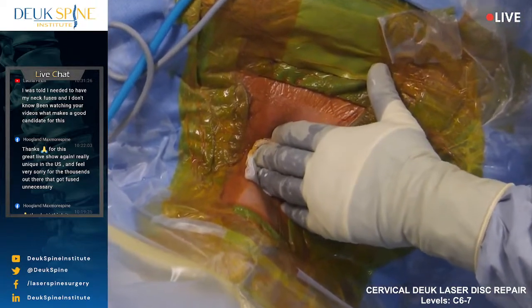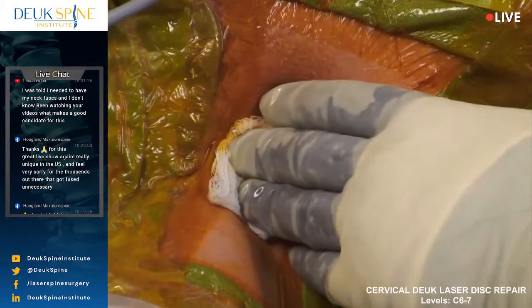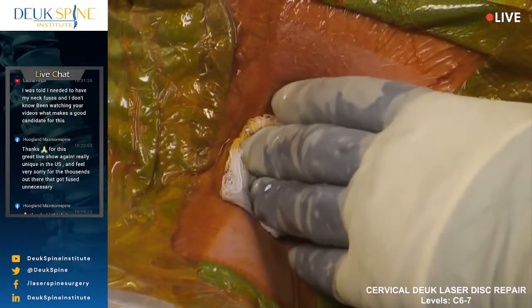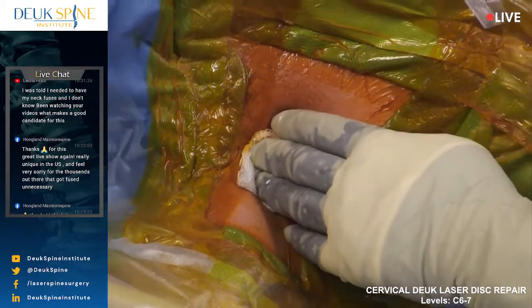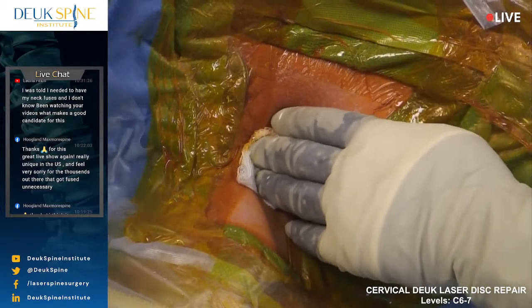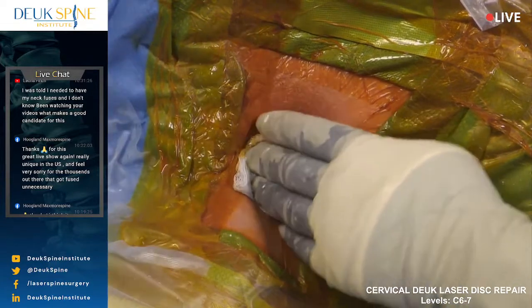He's just gagging. Because I'm putting pressure right here on his trachea, you know, if you put your finger on someone's throat, they're going to gag. That's all he's doing. We want him awake, but we don't want him awake just this moment. So we're going to put him to sleep for a couple more minutes while we put his bandage on, and then we can wake him up in a controlled fashion.